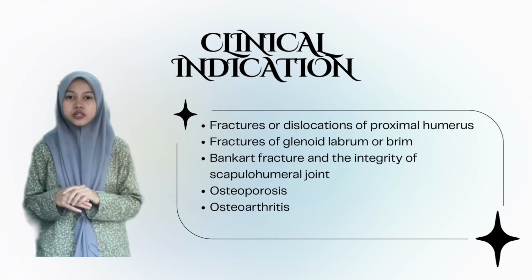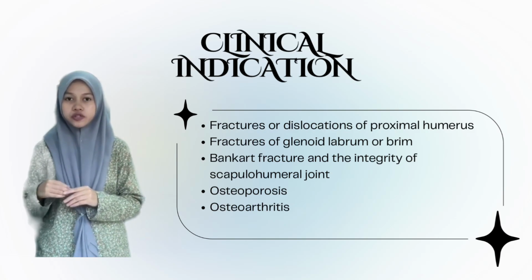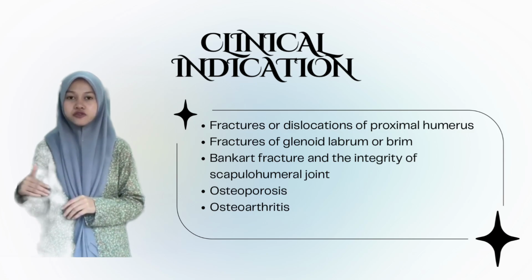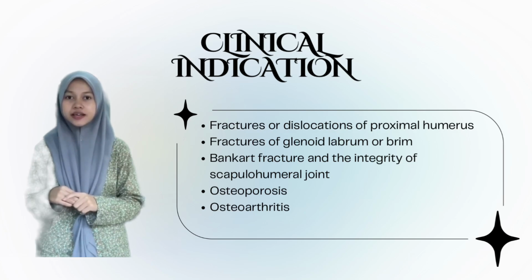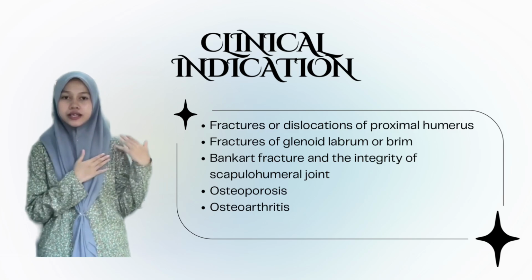Fourth, this examination is also indicated for patients with osteoporosis, a condition that weakens the bone. And lastly, for those with osteoarthritis, a degenerative joint disease that can cause pain and limited movement at the shoulder.